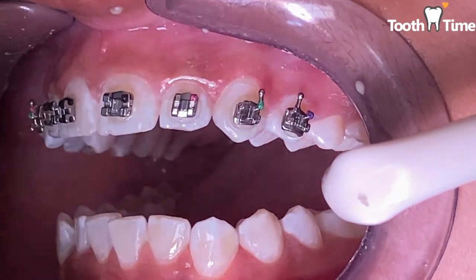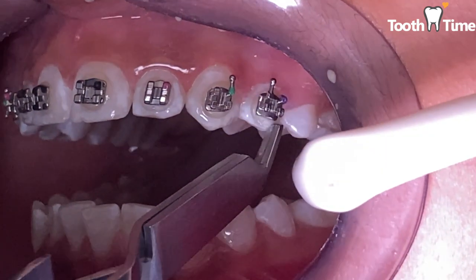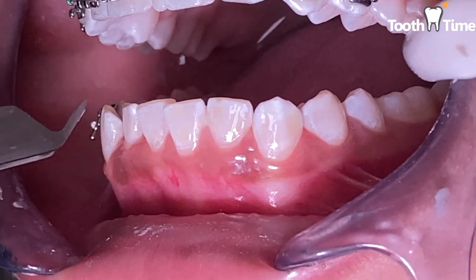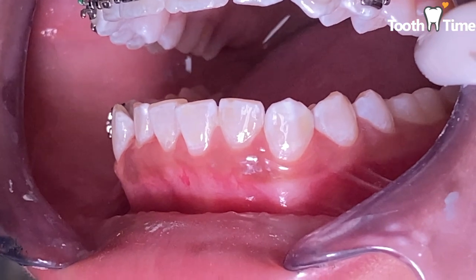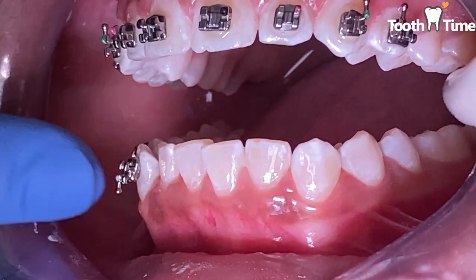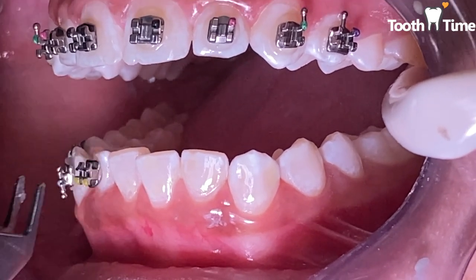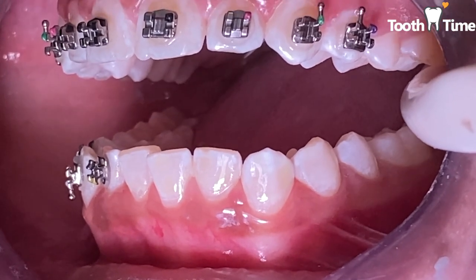On the top you might notice she doesn't have that much crowding and you're probably wondering why put braces on the top and not just the bottom. Remember, whenever you move teeth on the maxillary or the mandibular your bite is going to change. So if you just put braces on the mandibular, you'd have to put braces on the top too to help with any bite adjustment. Sometimes that's why we incorporate the rubber bands — click the link above and it'll take you straight to that video.